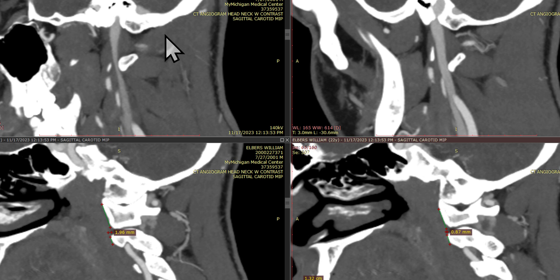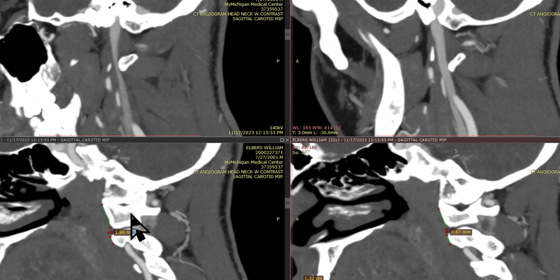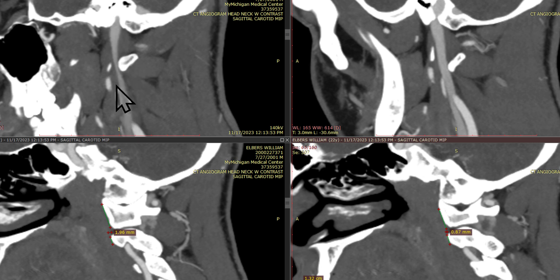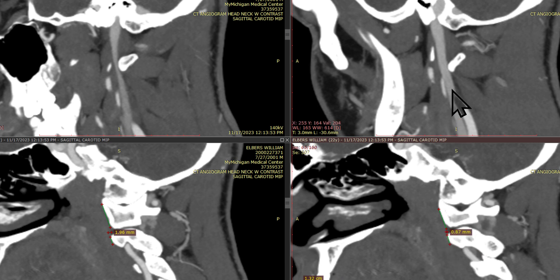That maps directly to what's going on with the C1-C2 facet joint. Here we have an offset of about 2 millimeters between C2 and C1, and that corresponds to the position that is causing decreased flow. And here we have less of an offset between C1 and C2, and that corresponds to a position where we have more flow in that IJV.